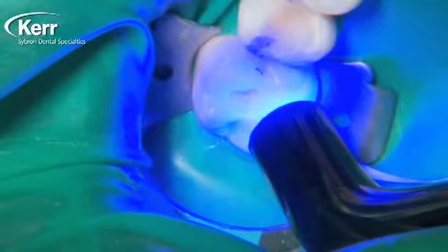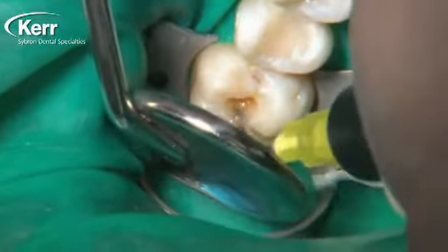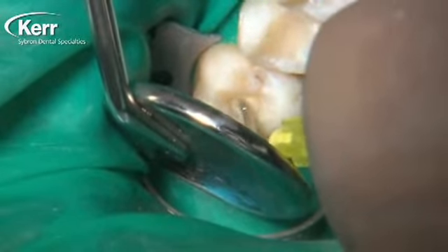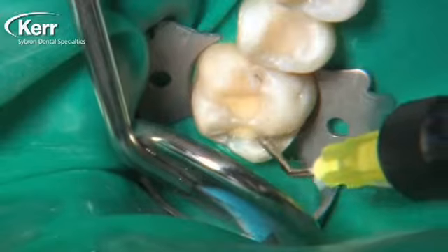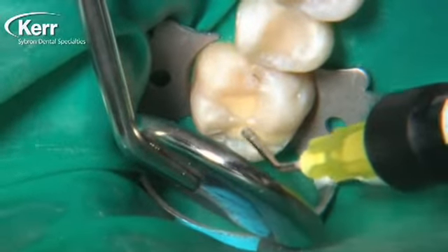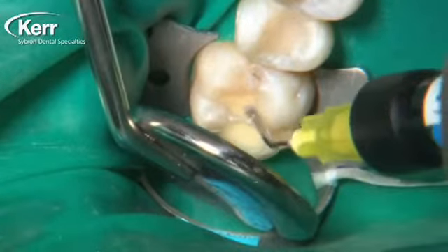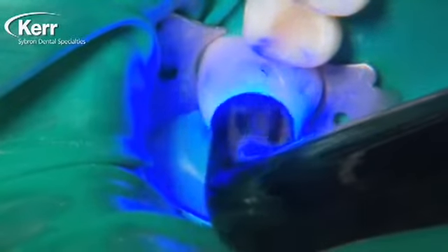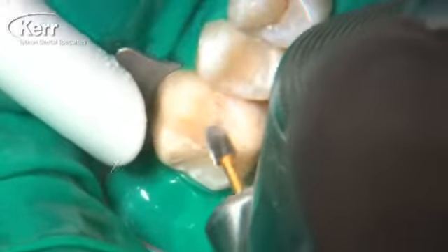As I look at these preparations now with that first layer of liner built in, I realize they're shallow enough that I can actually use the Vertice Flow as the entire restoration. For larger composites I like to use something stronger like the Herculite Ultra we used on the tooth in front, but for these smaller restorations, most dentists I talk to do use a flowable composite. You can use the same composite you use for a liner as your final restoration. We place some more Vertice Flow into the preparation — no need to agitate it — and cure it for 20 seconds.